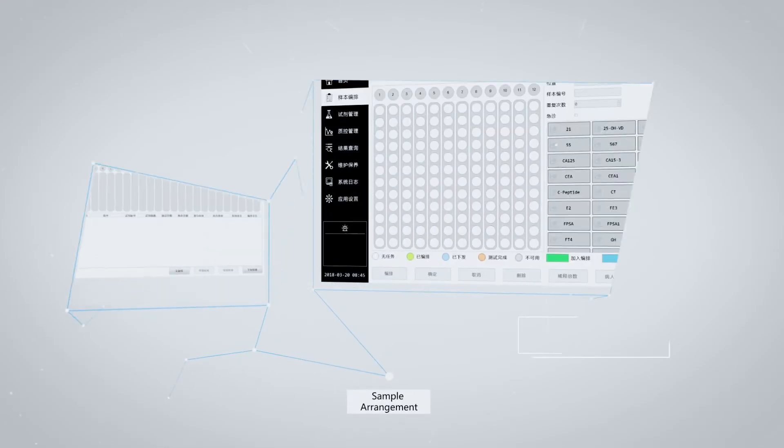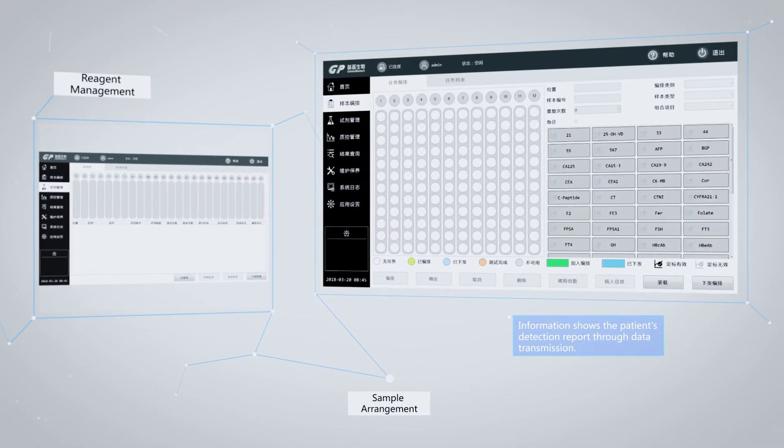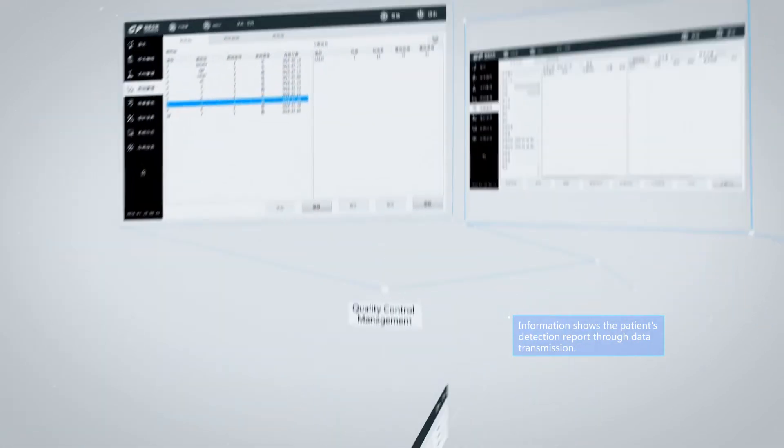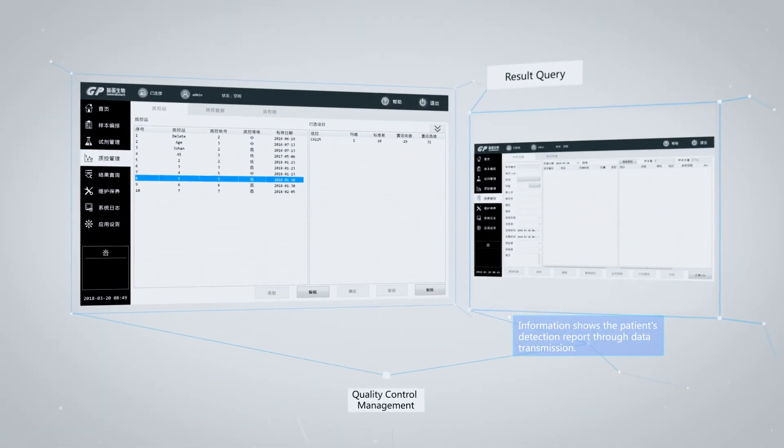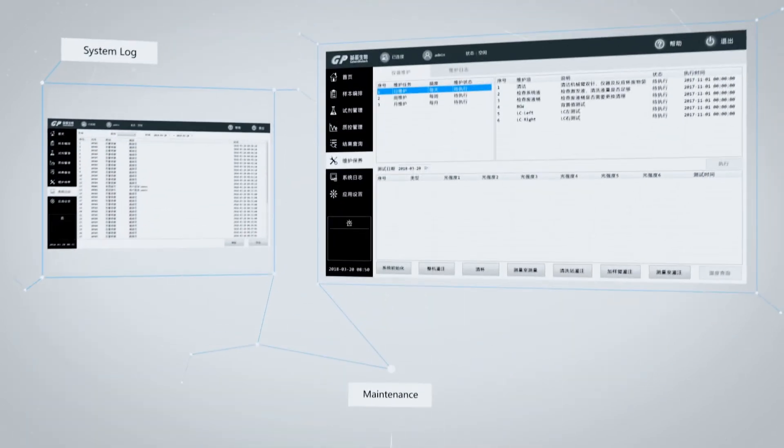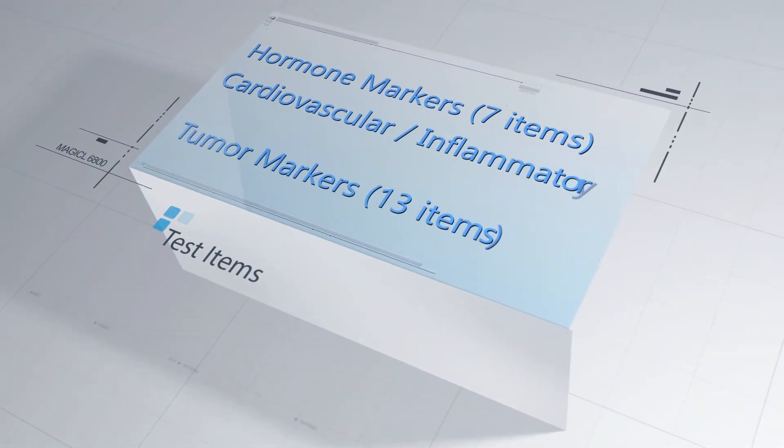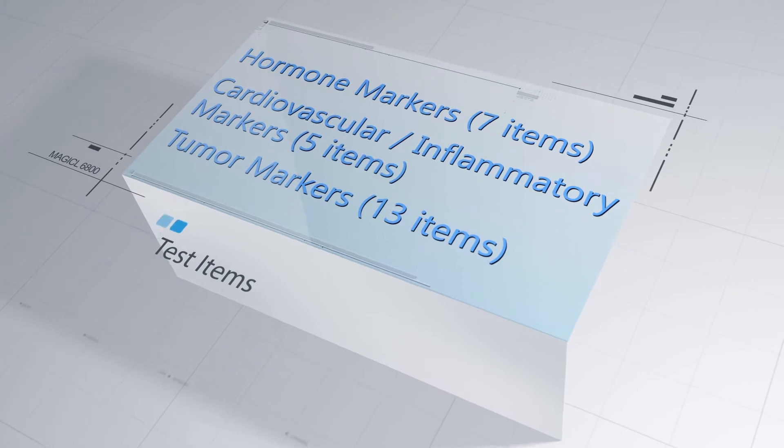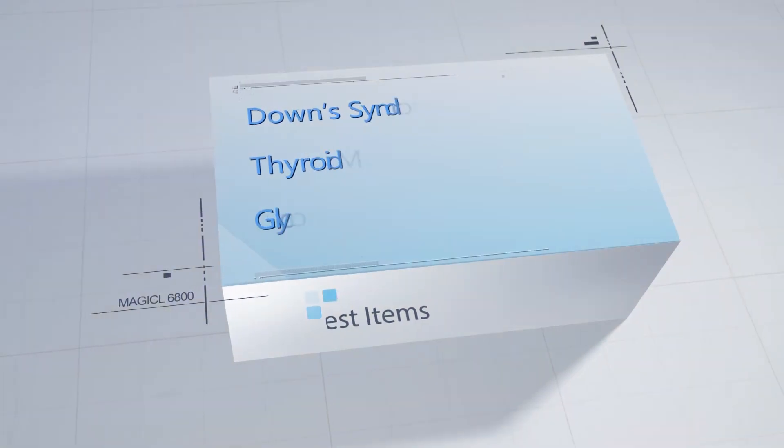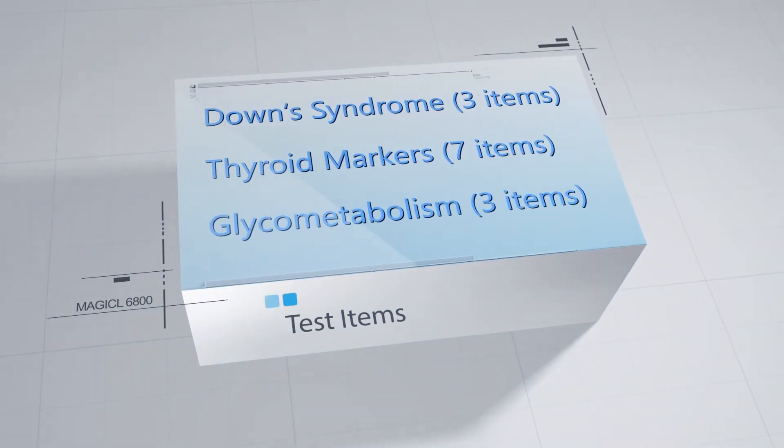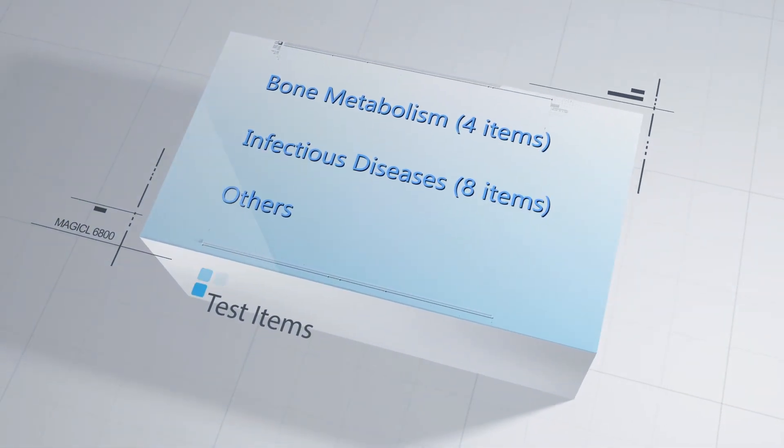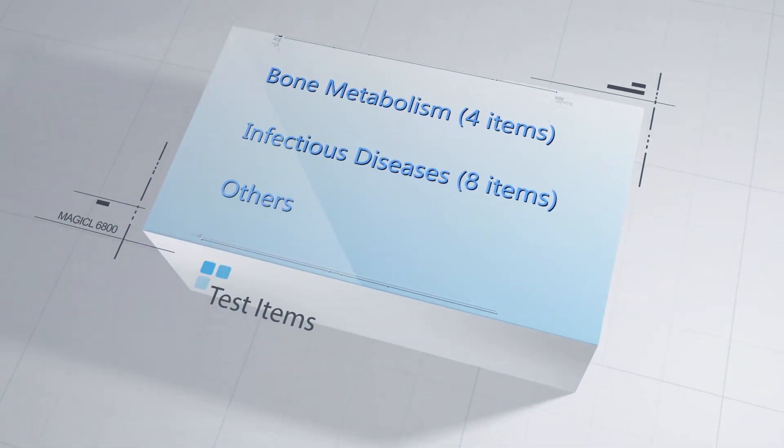User-friendly interface with real-time transmission of test results. With multi-testing items on Magicl 6800, our chemiluminescence immunoassay analyzer can be applied in different areas and can reduce hospital equipment as well as labor costs.